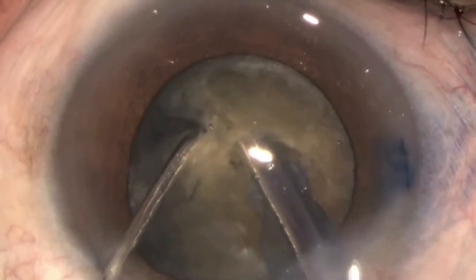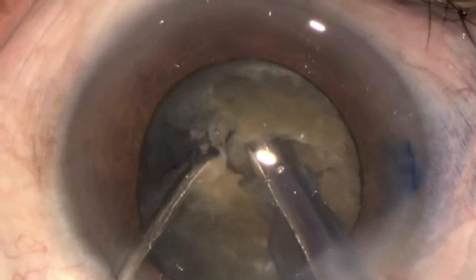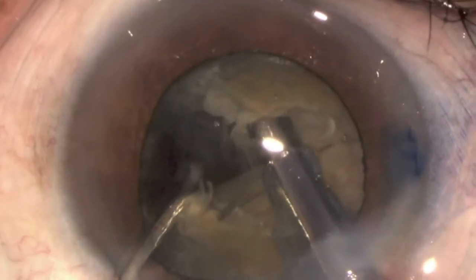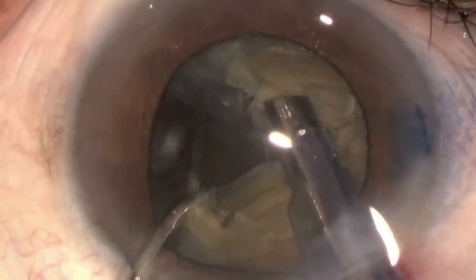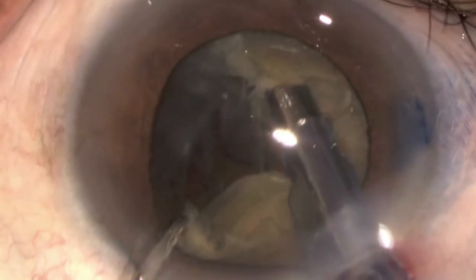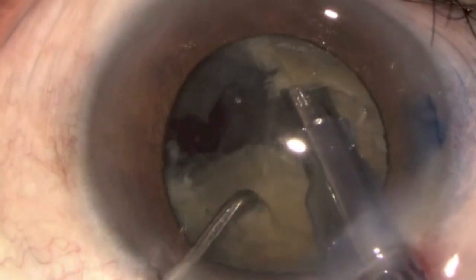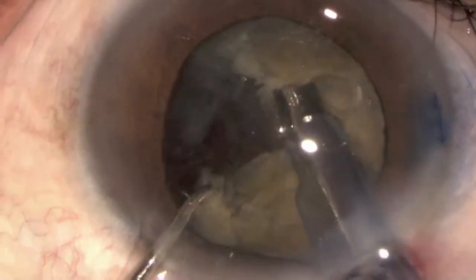The chopper then takes position within the nick to achieve a firm hold of the nucleus and stays there. Do not make any horizontal excursion. Once both the instruments have achieved firm grip of the nucleus at the equator, the chopper and phaco tip are then separated 90 degrees laterally to initiate the nuclear tear from the initial nick given at the equatorial edge of the nucleus. The force vector of 90 degrees lateral separation is then continued until splitting the entire nucleus from equator to equator through the center into two complete clean halves.